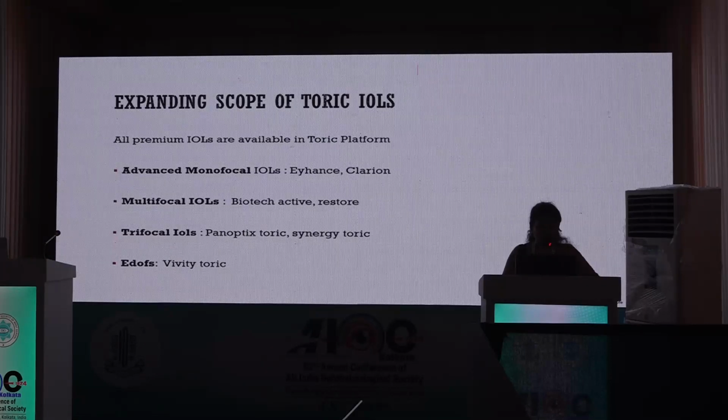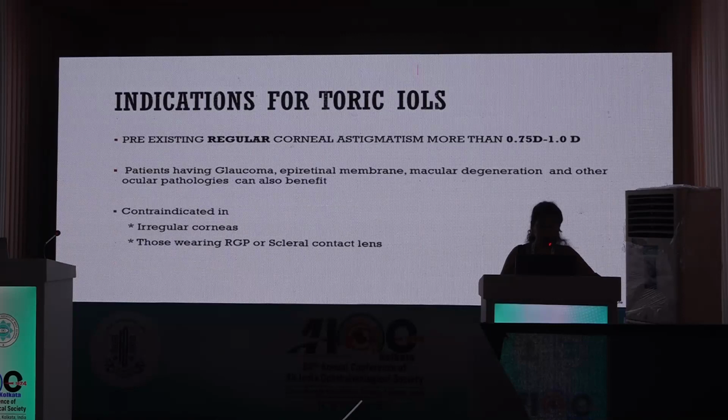All the premium IOLs which are available are also available in the toric platform, because as we are promising the patient better vision, we need to take care of small to moderate or even high astigmatism that the patient may be suffering from. Advanced monofocals, multifocals, trifocals, EDOFs, most of the lenses also have the toric platform.